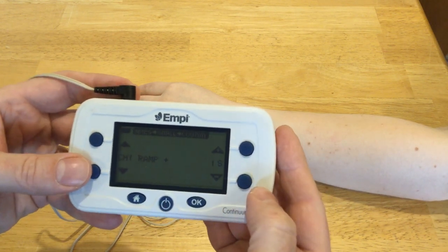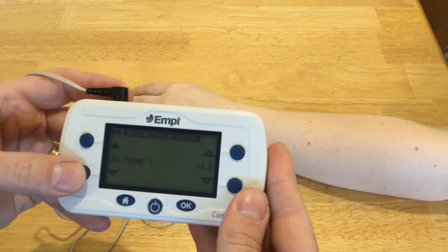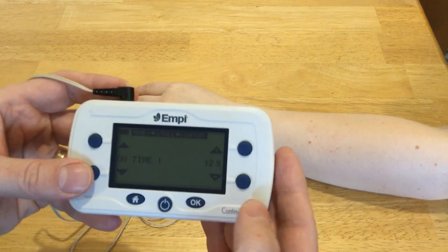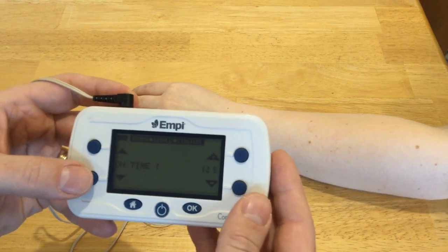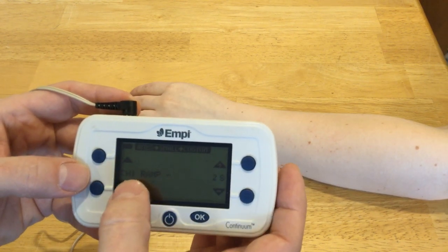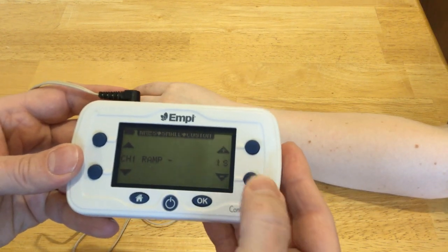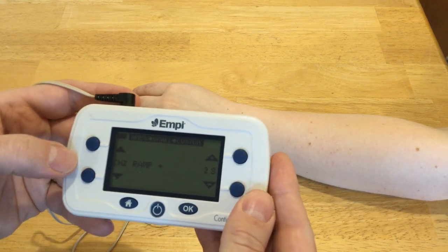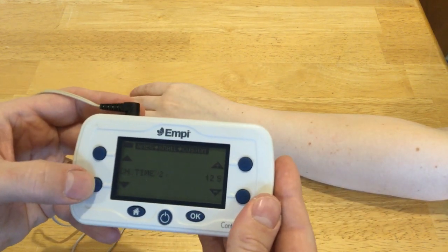I'm going to take ramp up down to one second just so we can see things faster in the video. Then how long is the on-time for channel one — I have it set for 12 seconds, that sounds fine. And how long to ramp down — I'm going to change that to one second as well. Channel two I'm not using, so I don't really care what those are set for.